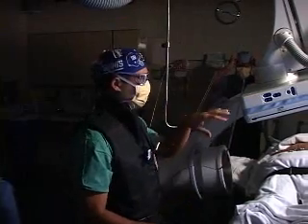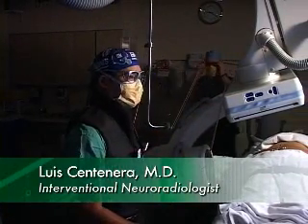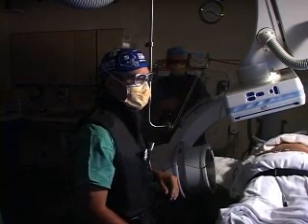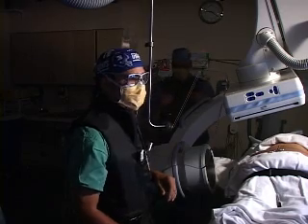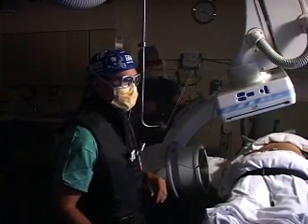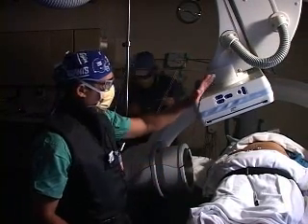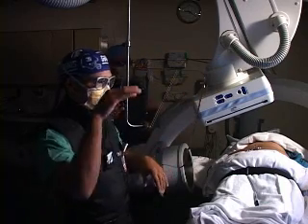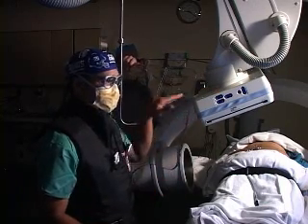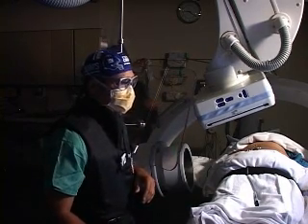What we have here is essentially a quasi-biplane way to look at the anatomy. When I set up my AP view, I like to put the spinous processes midline. Then I tilt my gantry so that I see the superior endplates and the inferior endplates tangentially. If the bone is compressed, I have to look at the ones above and below it.